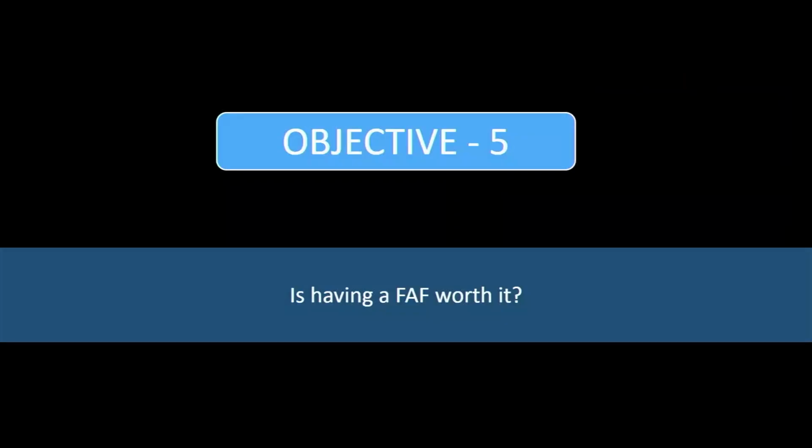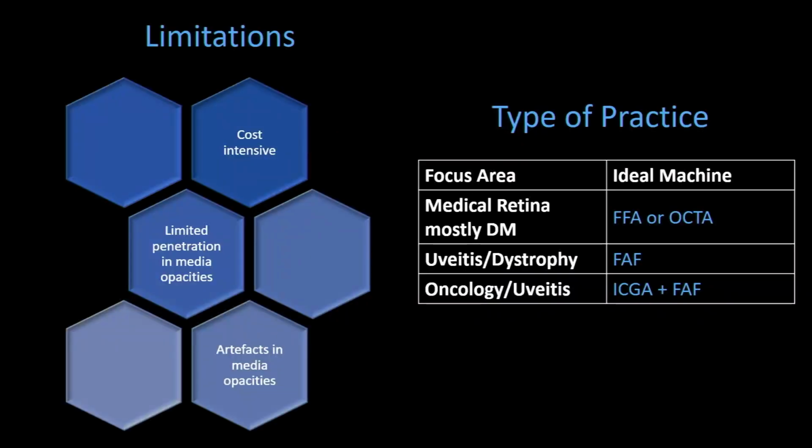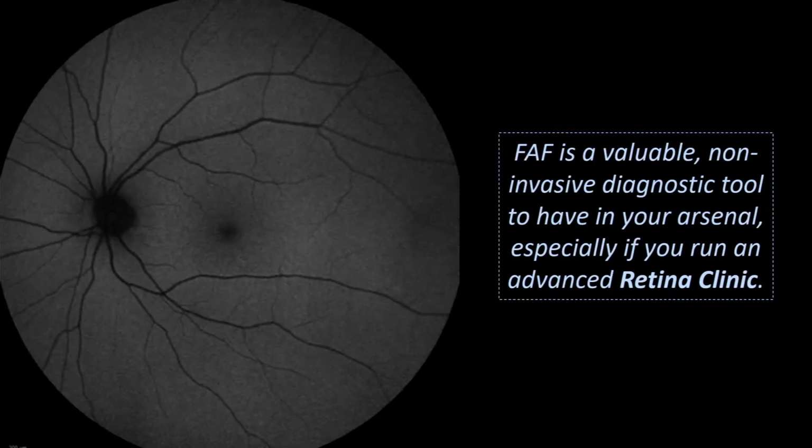So after all this, in my retina clinic, is having a FAF worth it? Yes, it has certain limitations: cost, limited penetration, artifacts. But if your retina practice is a little bit inclined towards uveitis, dystrophy cases, degeneration cases, or the oncology side, FAF is the non-invasive investigation for your retina clinic.